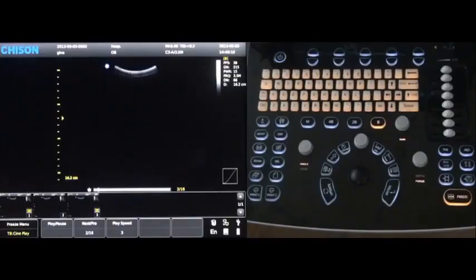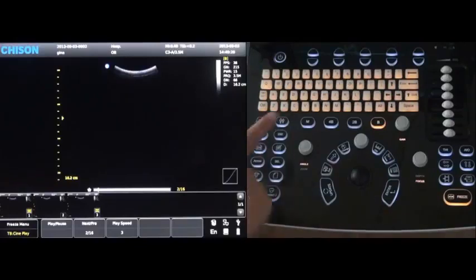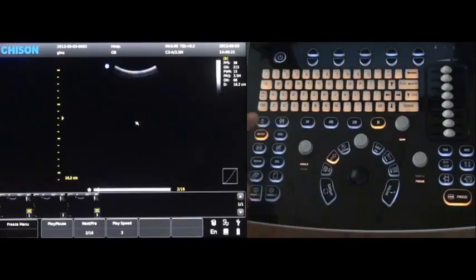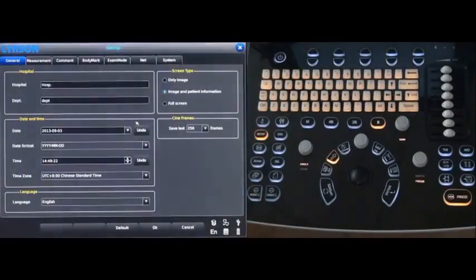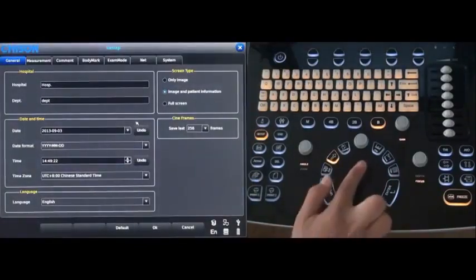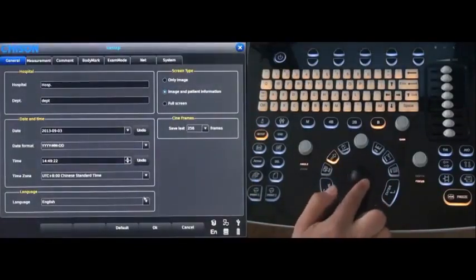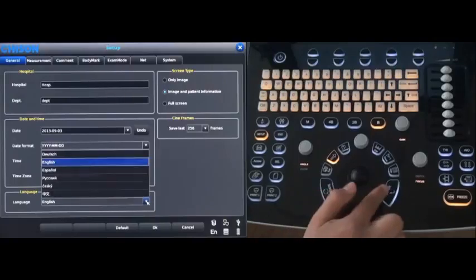Go to the system setting by pressing the setup key. Change the language for the general setting.